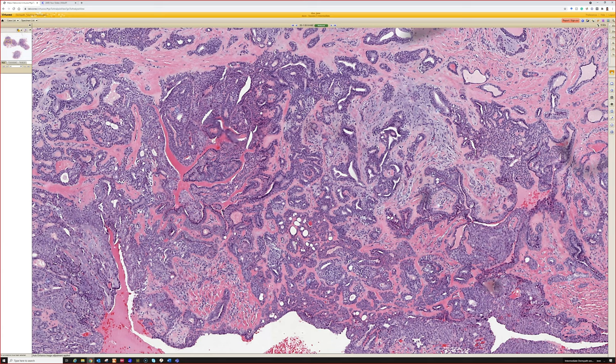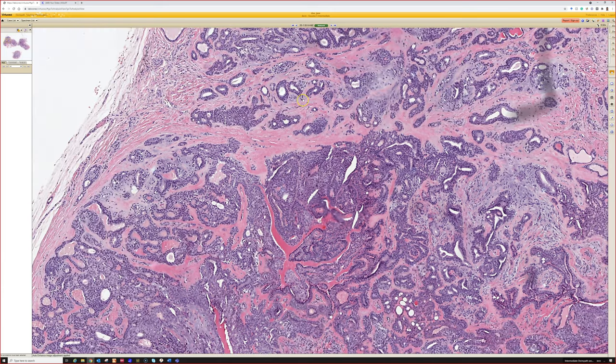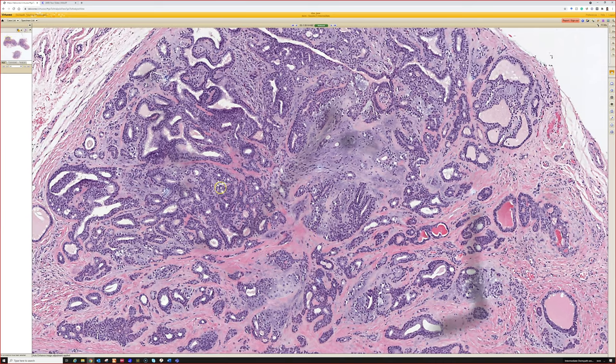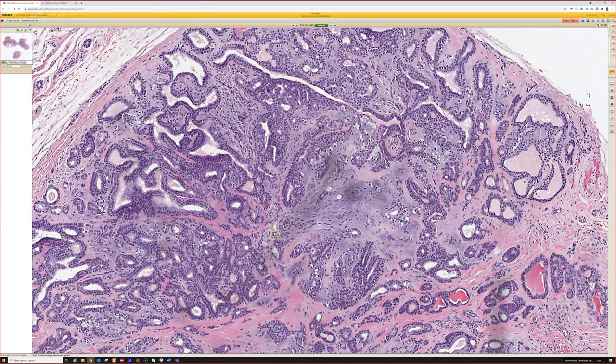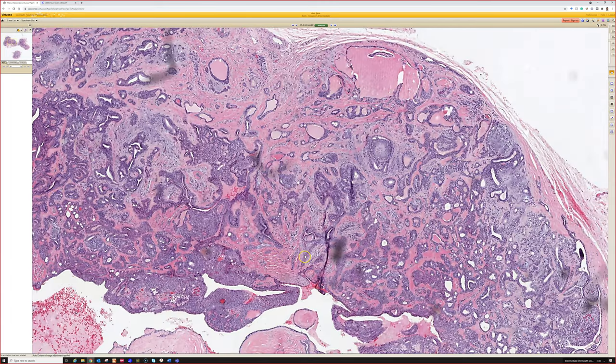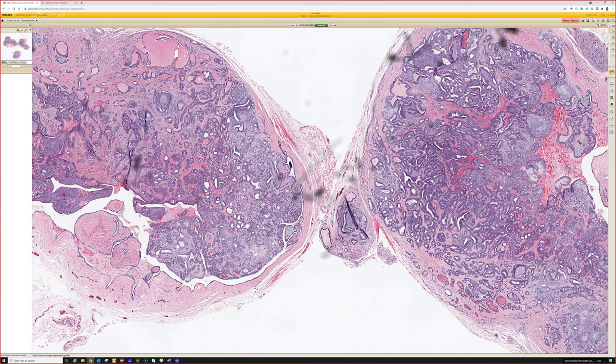Well, I think that's an explanation: the stem cells that give rise to the pilosebaceous unit and the apocrine glands can give rise to tumors that have overlapping features between those. So don't be disconcerted or alarmed if you see tumors that break the rules and have overlap between those, because that happens sometimes. And definitely a mixed tumor, I've seen that. So a very nice example of a mixed tumor.